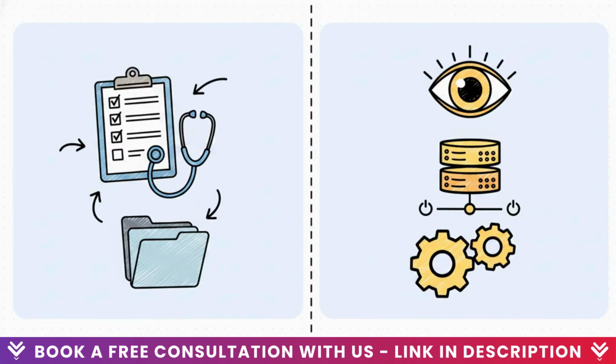Now, to architect this correctly, you've really got to separate these two concepts in your head. Use FHIR strictly for your information-centric workflows. That means EMRs, finding out what studies even exist, and handling the order and report metadata. On the flip side, use DICOMweb for the heavy lifting, the imaging-centric workflows, like pulling from PACS, post-processing, and parsing the actual DICOM instances. Draw a hard line there, and I promise you, your architecture will scale beautifully.